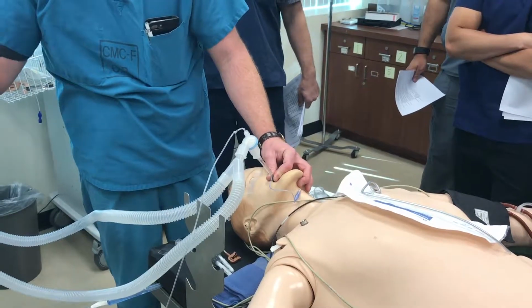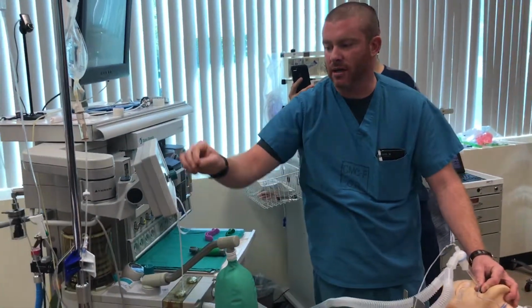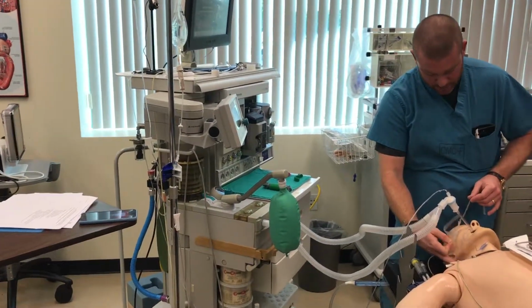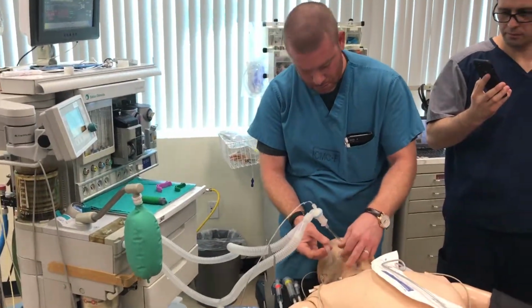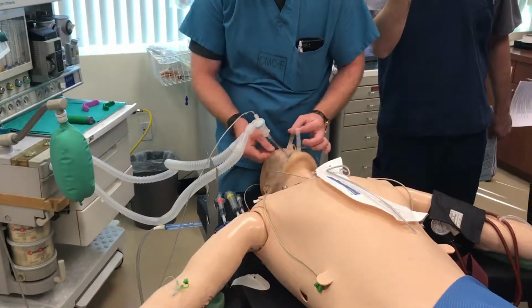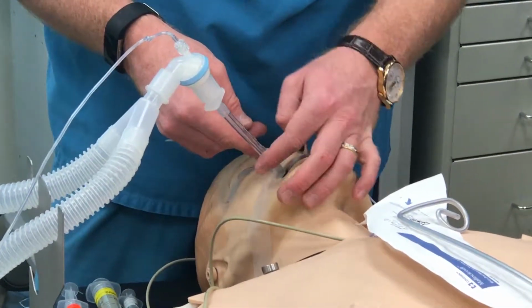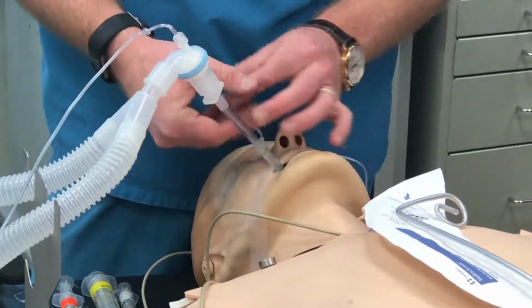turning him on the ventilator. I'm going to turn down his volume to 200 mLs. And I'll tell you why 200 mLs in a bit. Now I'm putting the tape on. When you tape this, don't tape it up here because that will allow this to move, right? Tape it as close as you can to where you place the tube.